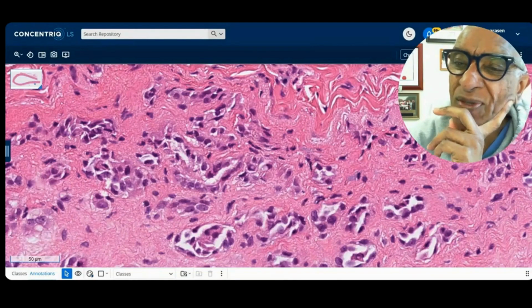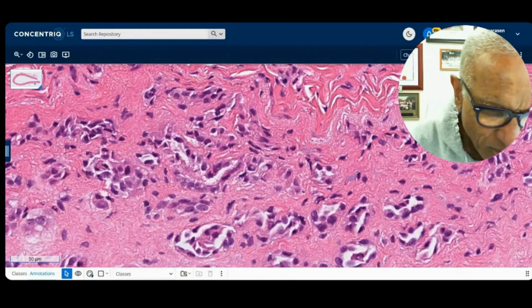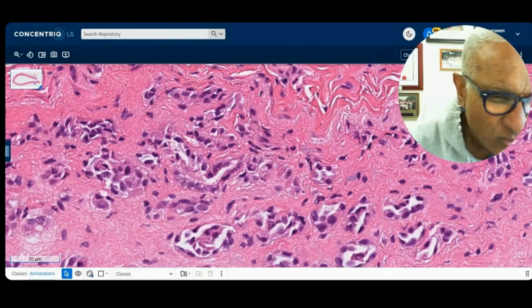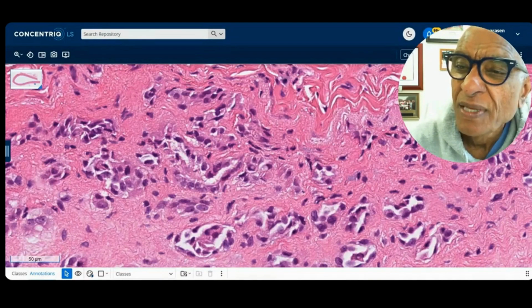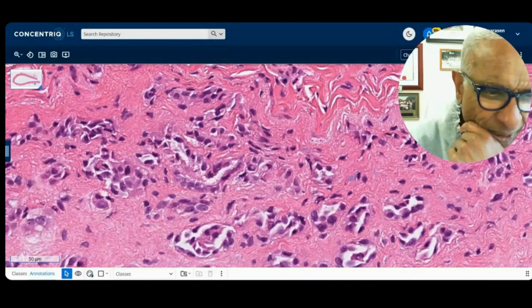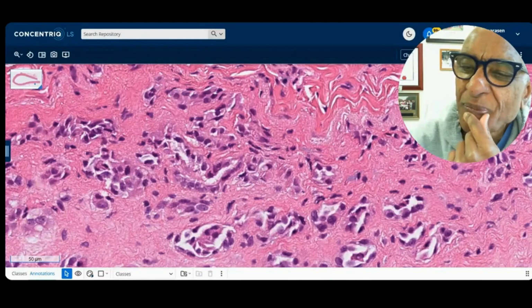Sheena, hemangioendothelioma, looks vascular in origin. I can understand why you said that, because some of these look sort of vascular-like or vasoformative. They seem to have lumina. I did not want to use the word gland-like. That would be another descriptor, gland-like. And then Gerson saying a cytokeratin stain may be helpful. So Sheena, these are not vessels. I did not do stains for vessels, but they're not vessels. When I reveal to you what they are, you'd understand why I did not do vessels.